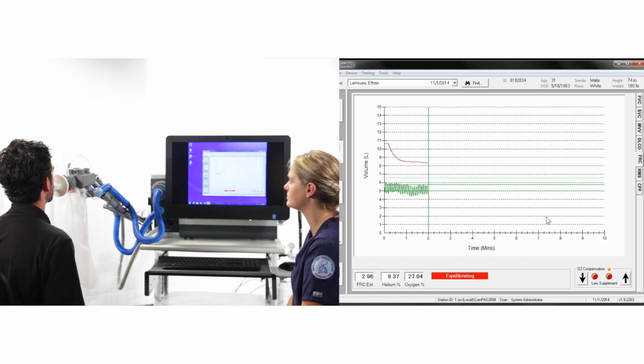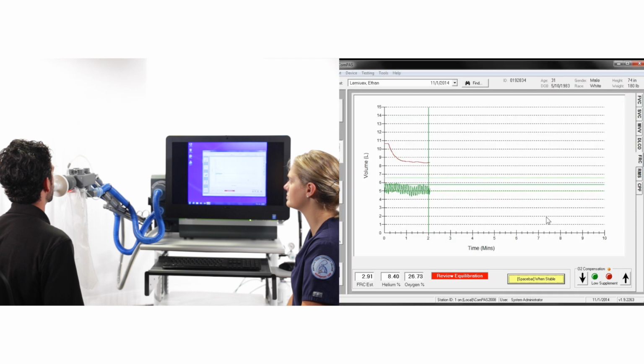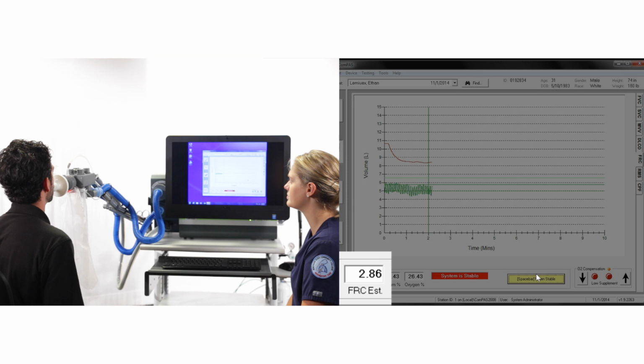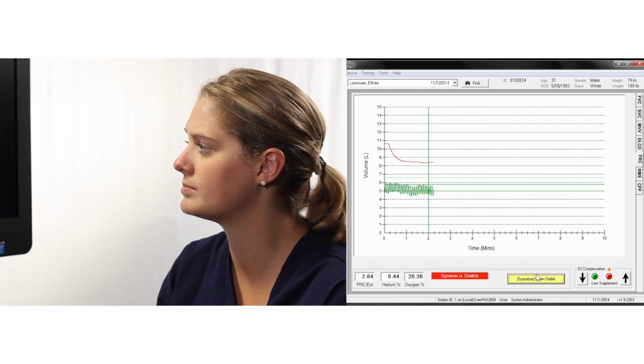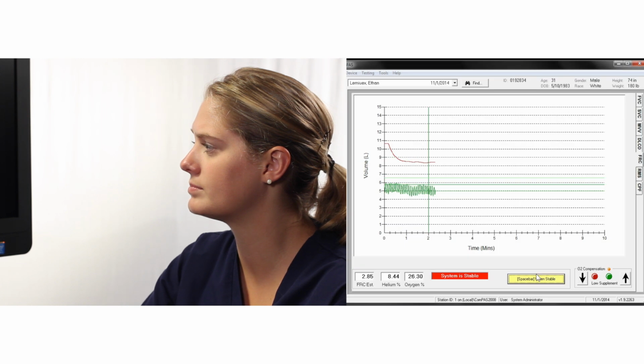Once the software sees a stable helium condition, the screen will ask you to review equilibration. The helium dilution curve should now be a flat line, and the estimated FRC should also be stable. When you are satisfied that complete equilibration has been reached, press the space bar.